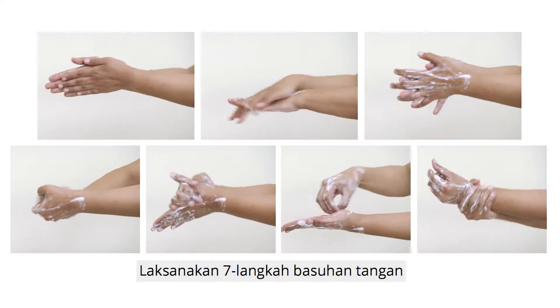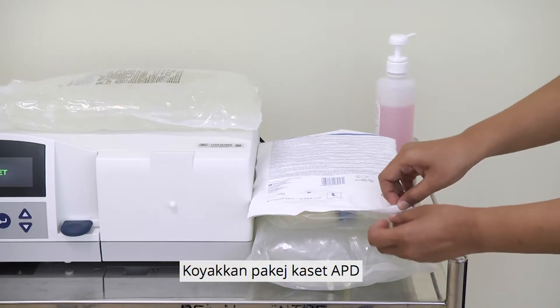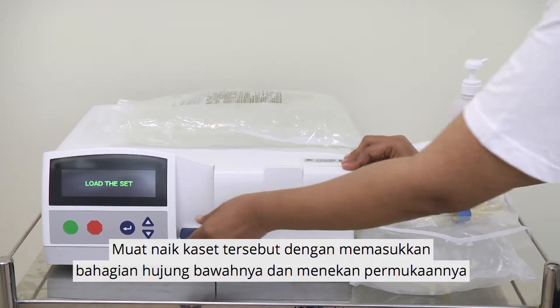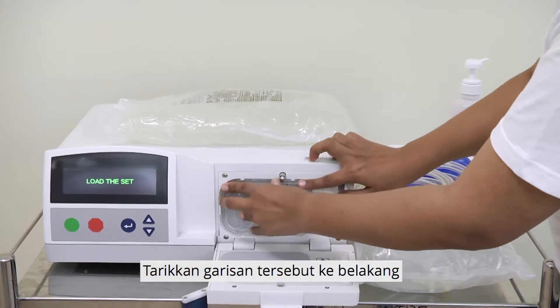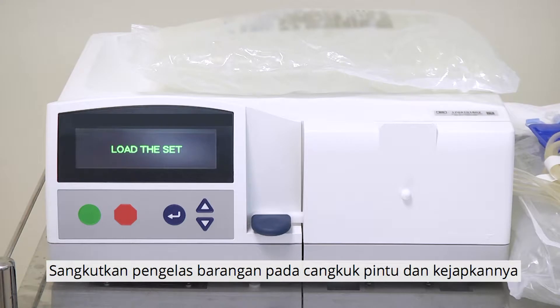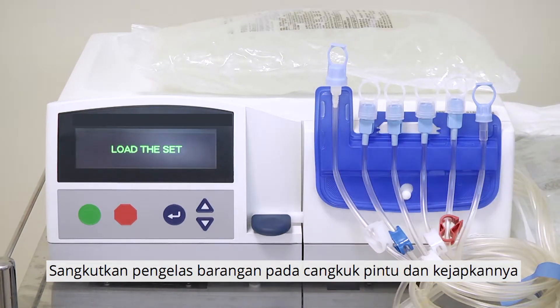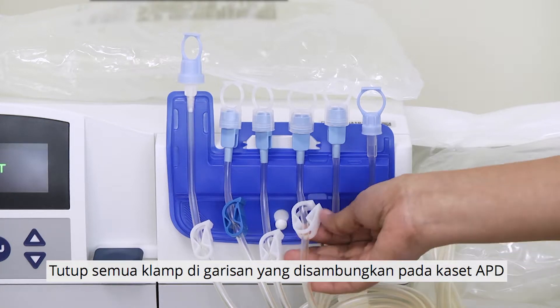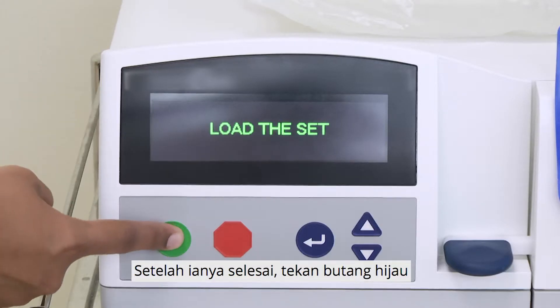Perform the 7-step hand washing. Dry your hands completely with a clean paper towel. Tear open the APD cassette package. Load the cassette by inserting the bottom edge and pressing the top. Pull the lines backwards. Close and lock the door. Place the organizer over the hook of the door and secure it. Close all the clamps on the lines attached to the APD cassette. Once that is done, press the green button.